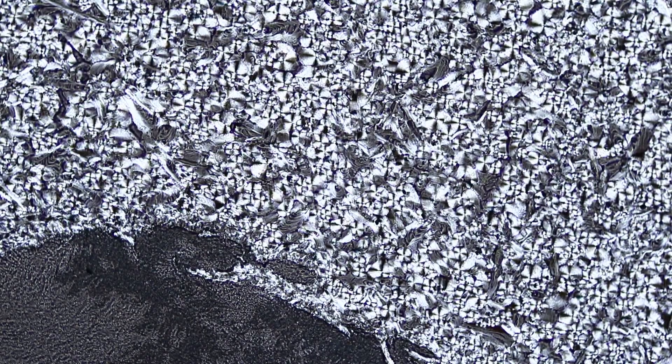Now let's look at the area. I was taught that gout crystals dissolve because of the formalin. But what we found is that even though this tissue is formalin-fixed, let's go find those pockets that looked like gout. Those pockets are now bright — you can see the needle-shaped crystals. It's a little hard to capture the polarization on video because of the camera adjusting the lighting, but here you can see a nice example right in those pockets that were not polarizable on the H&E section. They are polarizable on the unstained. One of my residents, Faisal Feta, taught me this — he found a paper describing that using alcohol-based eosin allows you to do an H&E that still lets you see the crystals. But an even easier trick is just cut an unstained section and look to see if the crystals are there.